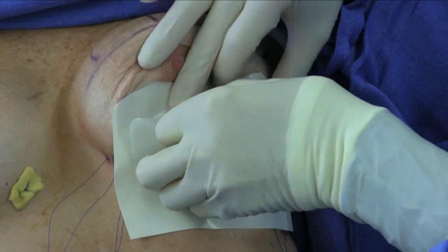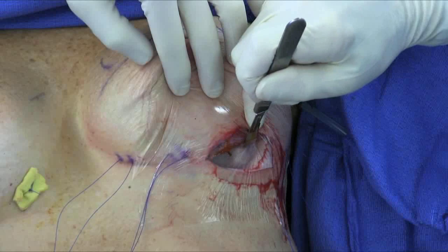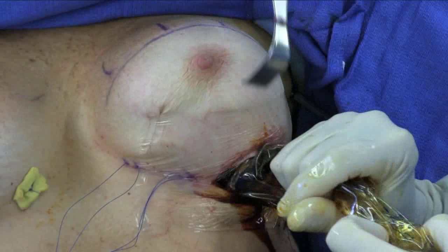Tegaderm protective plastic is then placed over the skin at the incision site. A solution of betadine and antibiotics is then placed within the pocket. The permanent implant is then placed within the pocket with the aid of an insertion funnel.